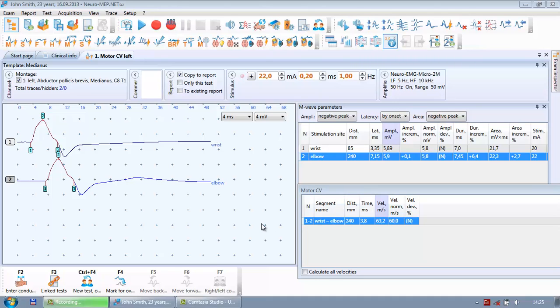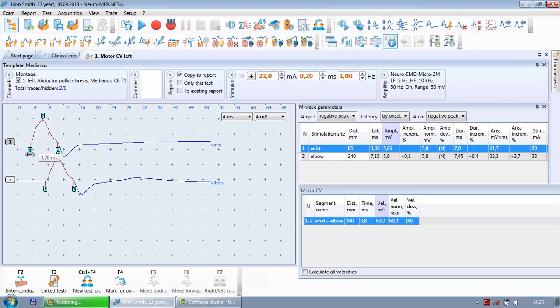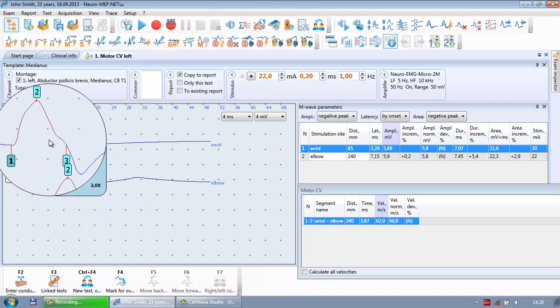When the software calculates velocity, it uses latencies. To make sure the latencies are calculated correctly, you must verify that the markers are placed correctly. Normally the software places markers more or less accurately, but you can always move them using the mouse or keyboard. To zoom in on a curve and see it at a higher scale, just press Alt and Ctrl together.